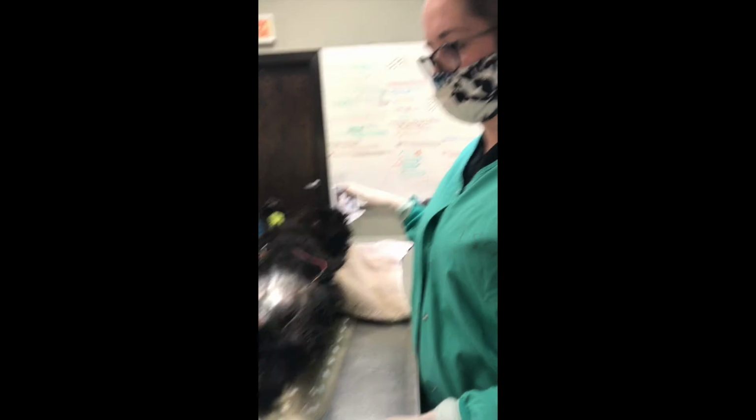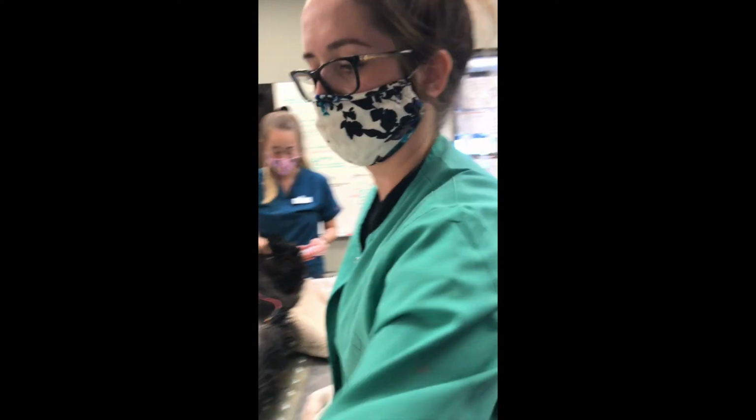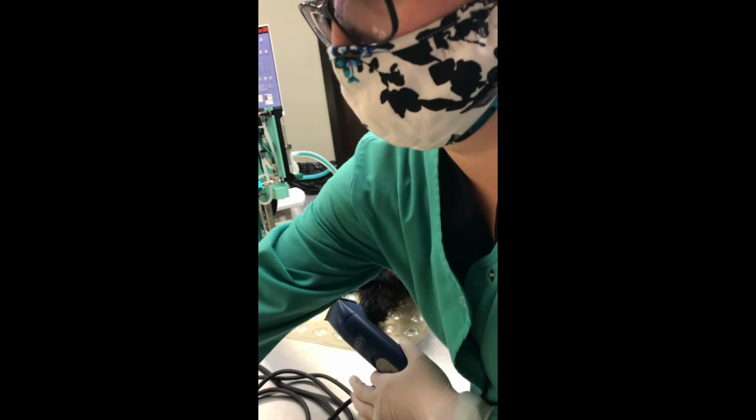So now that he is flipped on his back, he's got everything hooked up, we're going to go ahead and start clipping. He's getting neutered today.